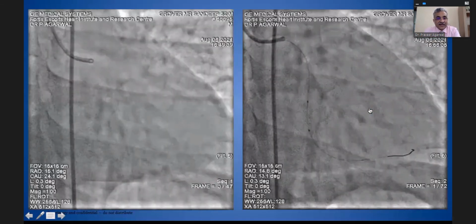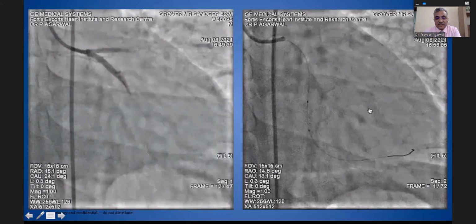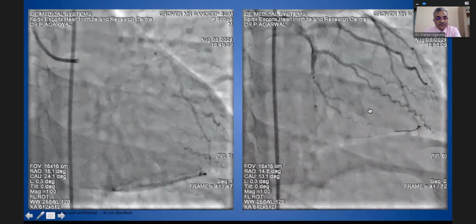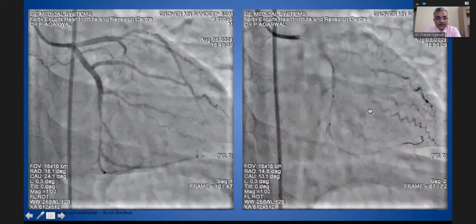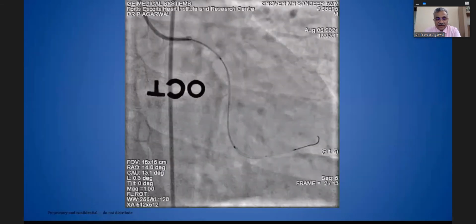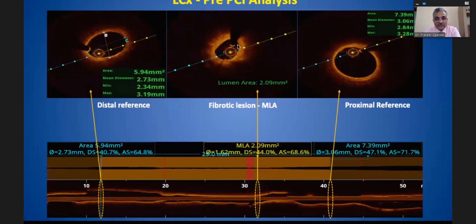Now see, this is a lesion where again the bioabsorbable scaffold has come into the picture. And we know that angiographically, or maybe in IVUS, you can't see much of these scaffolds in today's life. So it's a regular balloon dilatation. And now the OCT run to see the fibrotic lesion. See, this is a fibrotic lesion. These are all diabetic patients with a strong family history. And these lesions are really bad to dilate, very, very bad to dilate if you don't prepare them well.